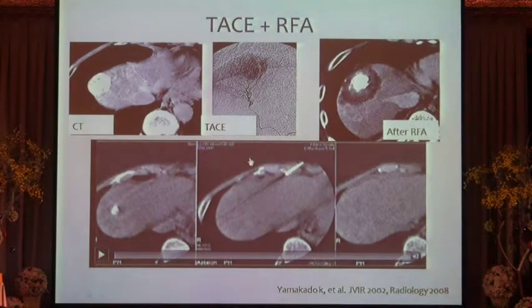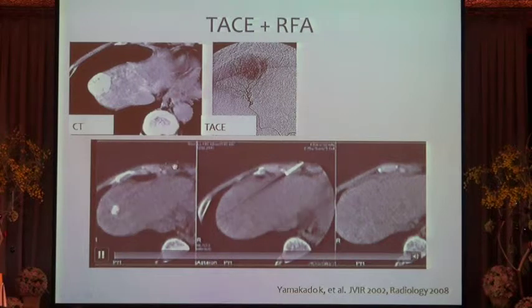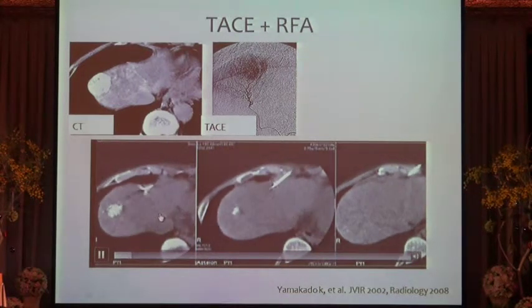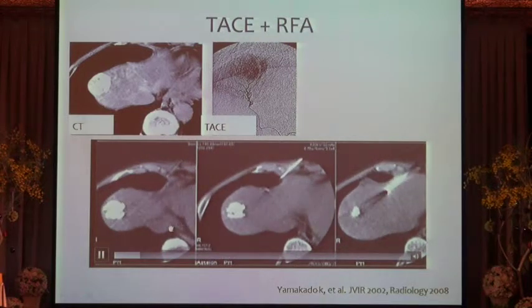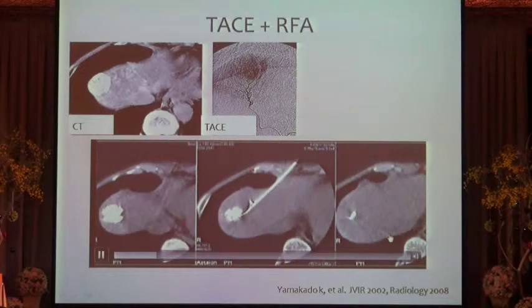This is a case with HCC lesion measuring 5 cm in maximum diameter. At first, we performed TACE followed by RF ablation. We are using real-time CT fluoroscopy like this. We have 3 images. This is the head side, center, and the foot side.